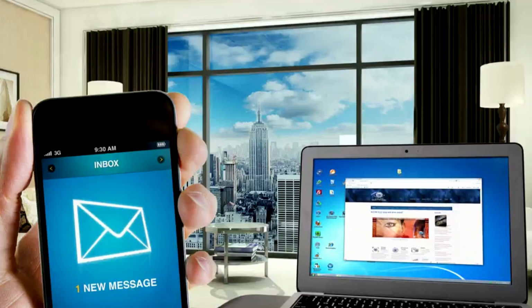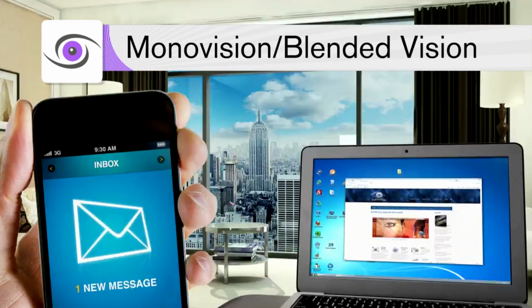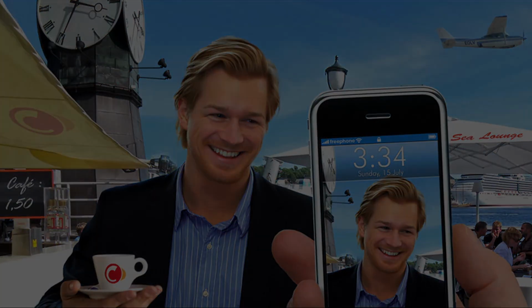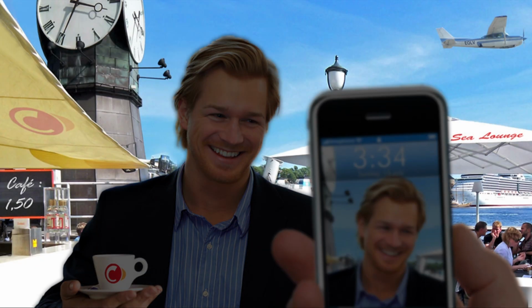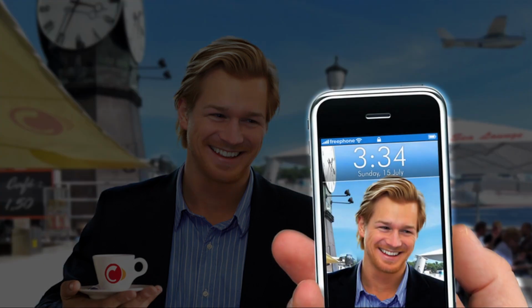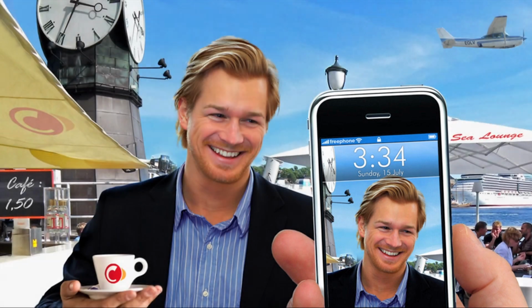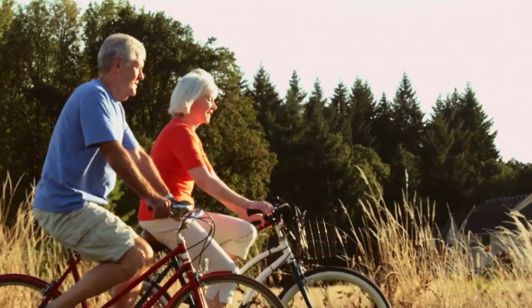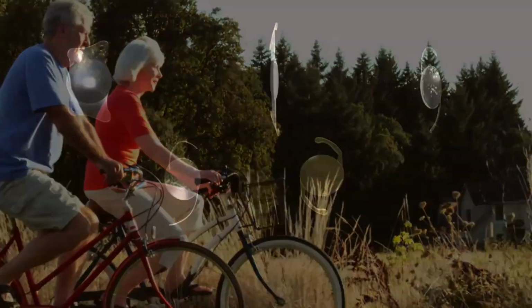Standard monofocal IOLs can also be used to reduce one's dependence on glasses if you should elect to have monovision or blended vision. With monovision, the lens implant in your dominant eye would be set for distance vision, and the lens implant in your non-dominant eye would be set for near vision. Your brain then automatically selects either the near or distant image that you wish to see. Monovision is well tolerated by many patients, but not everyone, so it may not be right for you.